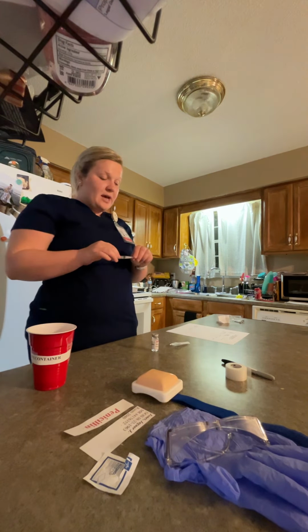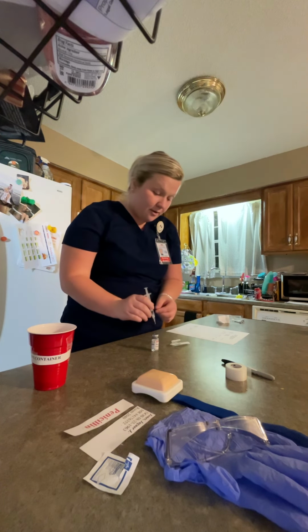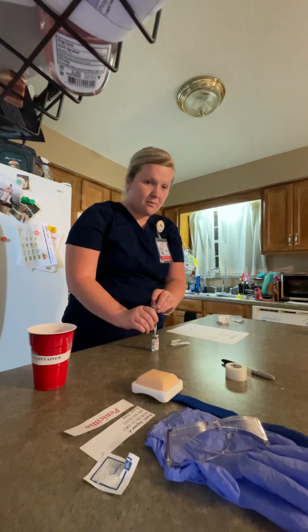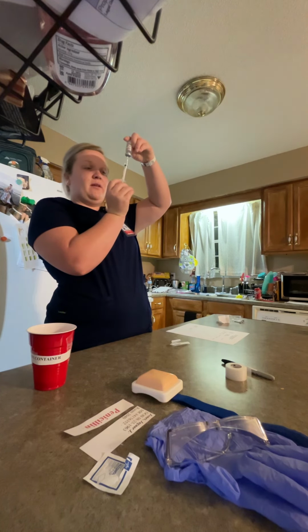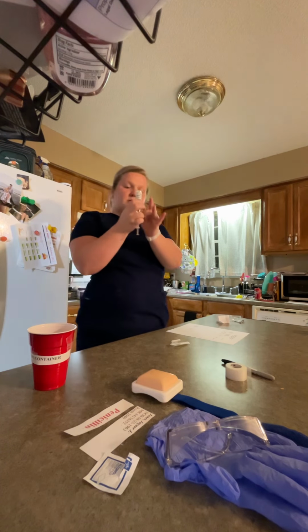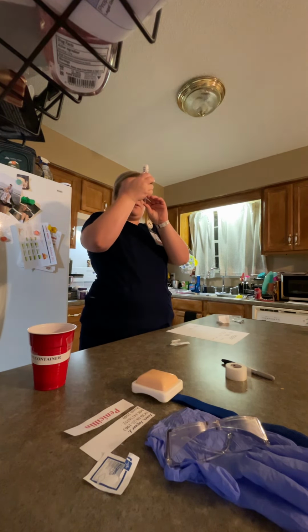So now I'm going to take the top off the blunt tip cannula and I'm going to inject the air into the vial. Flip the vial around and I'm going to draw up 0.5 milliliters of morphine sulfate. I'm going to draw a little bit more just to get the air bubbles out, and what I don't use I will put back in.